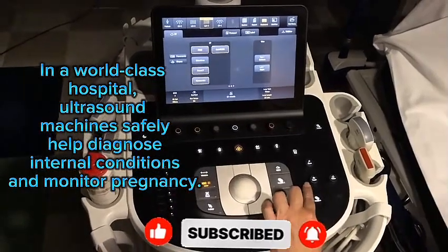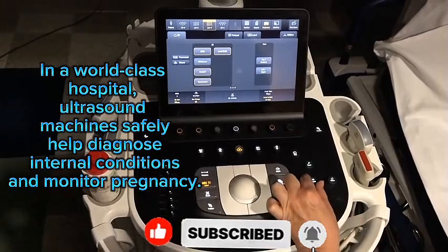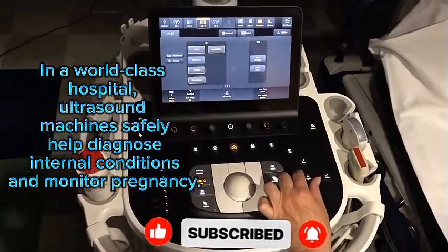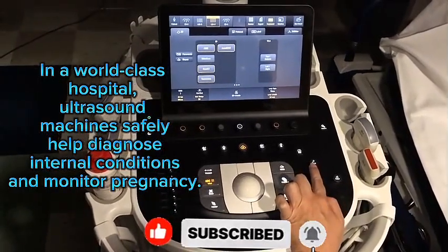Once again, if you want to increase your depth, you hit this button right here. You turn this button. You don't need to hit it. And if you want to zoom, this button right here.